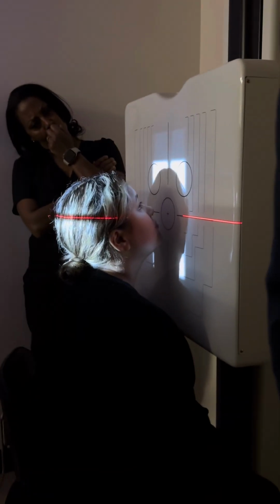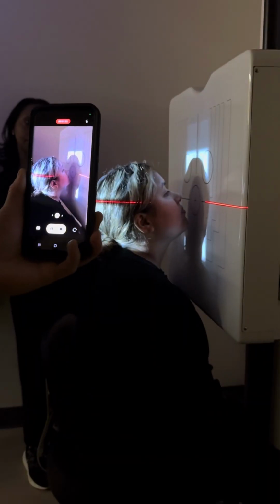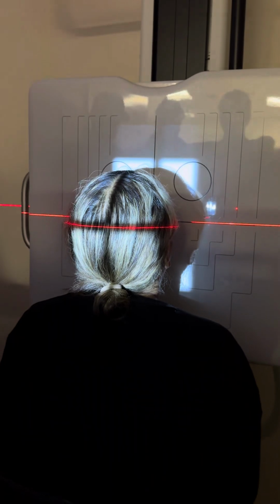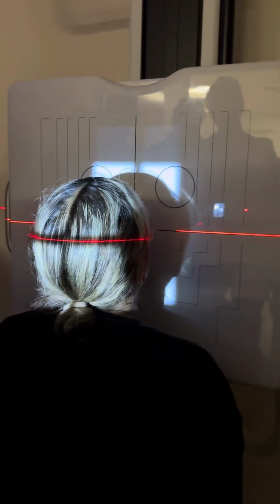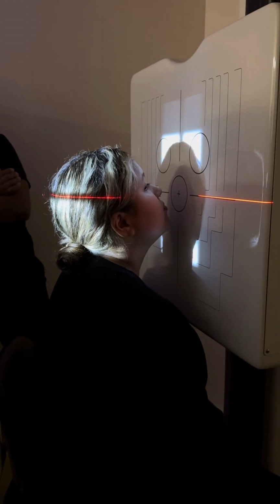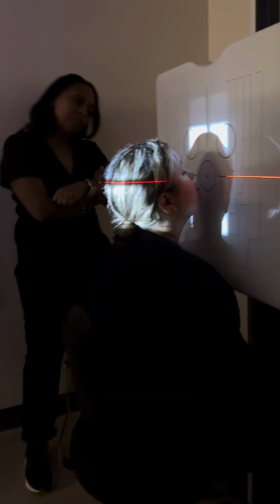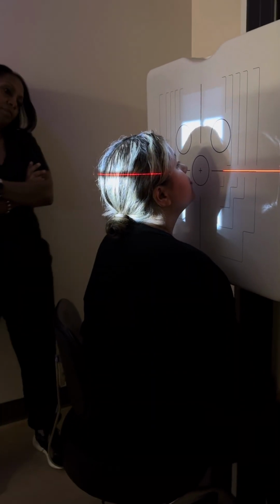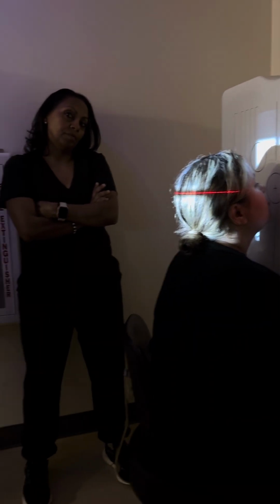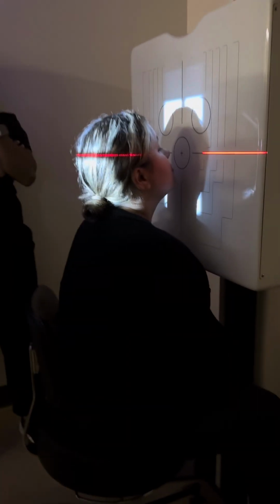It's very simple. You'll see these more often than anything else, because as I said, we do these for an MRI case when we're looking for metal. The way we'll handle that is the patient will be asked to look up during this projection. We'll change the image receptor, then we'll have them look down. If there's a piece of metal in the eye, it'll actually transfer across as a portion of the image. It's a little fleck. You rarely see it, but when you see it, you'll see it. And it's not your job to read it, it's just to do that. Look up, look down. For us, we do this for facial bones for the same reason people get punched in the face.